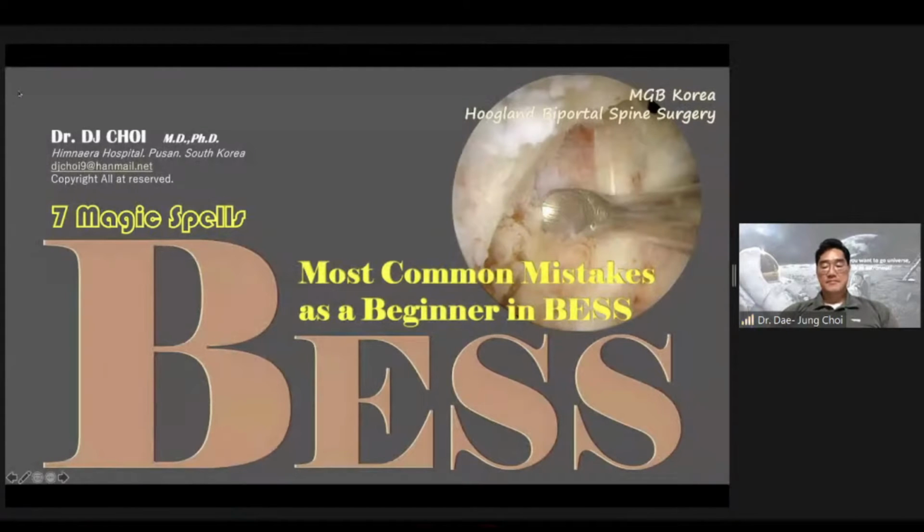Hi, I'm DJ in Busan, Korea. Thanks, Chairman, for having me present in this big meeting, and Hoogland Spine for supporting biportal endoscopic spine surgery. Today, my topic is common mistakes of new recruits who are performing biportal endoscopic spine surgery, shortly BESS or UBE.